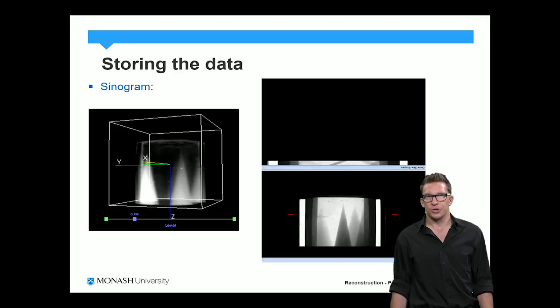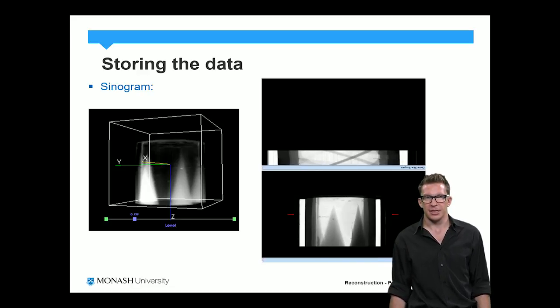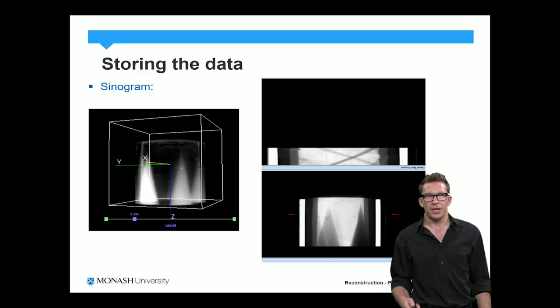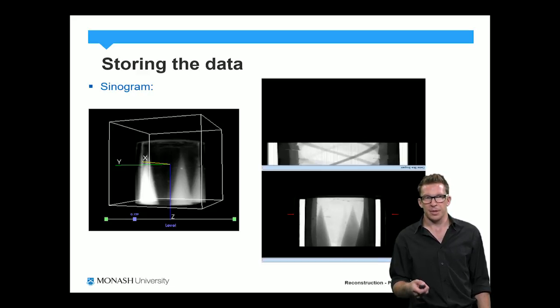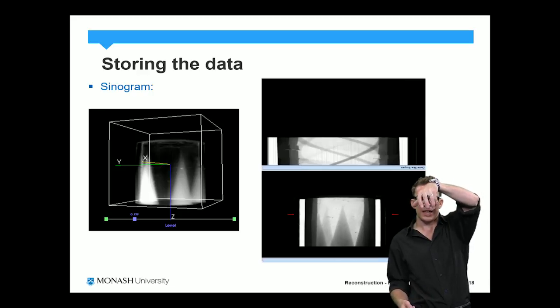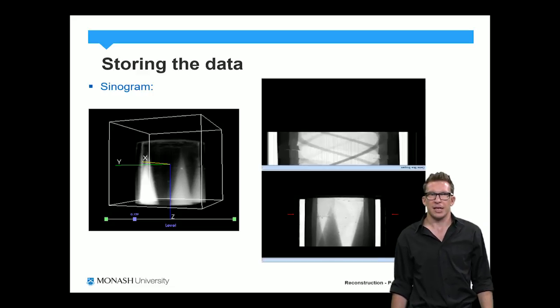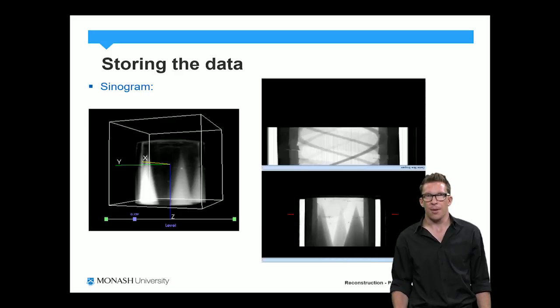Now, as part of the course, you'll also be using our optical CT scanner in order to improve your understanding of the CT reconstruction process. So here we can see, for a series of cones that have been placed in our optical CT scanner, as the CT scanner rotates the cones that are in the phantom, we can see the sinogram there being generated. And we'll come back to that in the practical class.